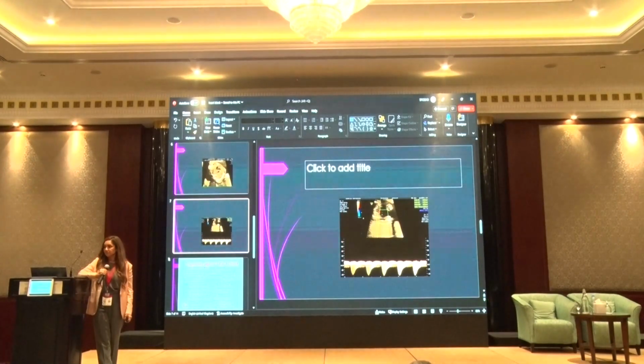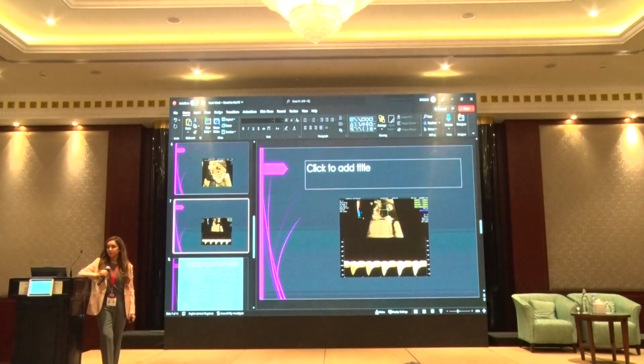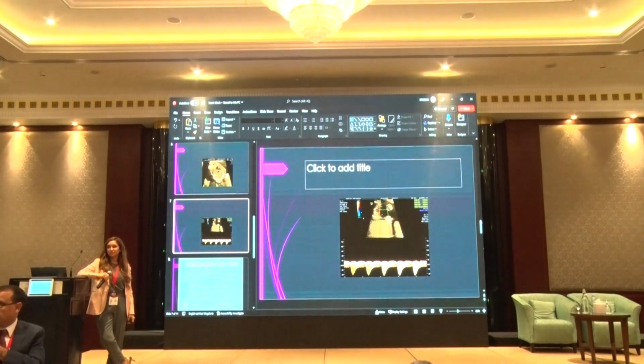Correct. So this is a very, very important signal. As a matter of fact, when you see the umbilical vein is not a straight line, there is really no pressure pulsation in it. It's supposed to be smooth blood going from the maternal placenta area to the baby's heart. It should be smooth without any pressure. If you see it pulsating like this, it is one of the signs. How many of you are familiar with the cardiovascular profile?